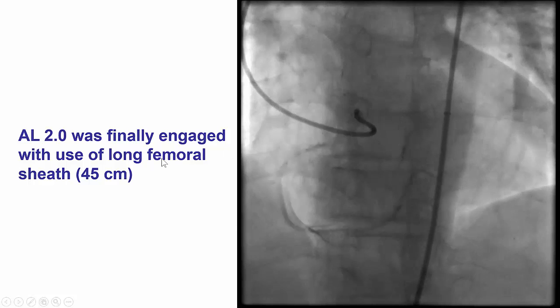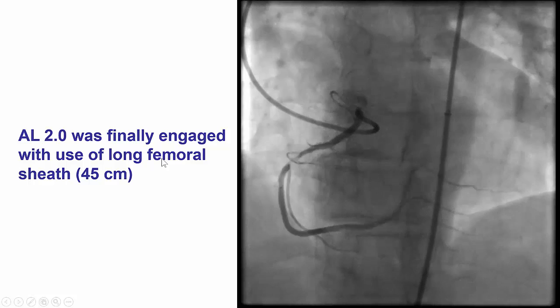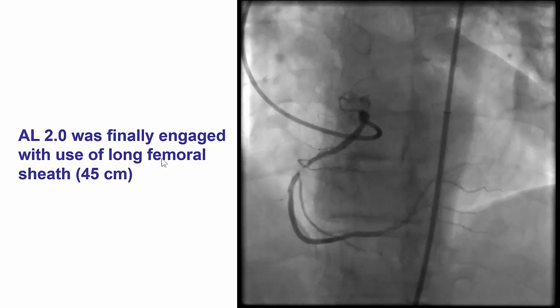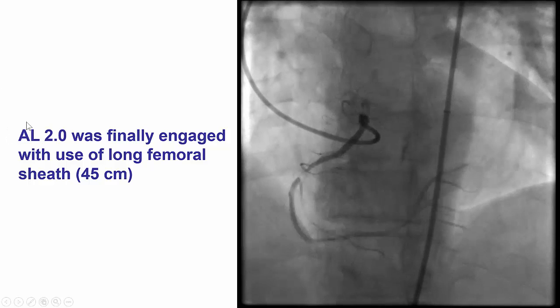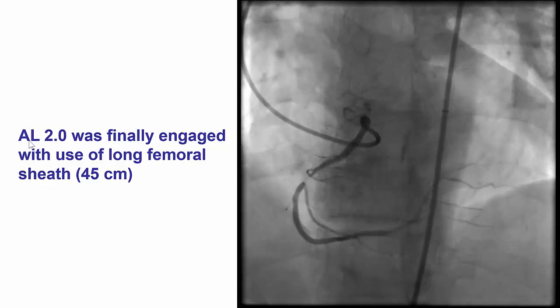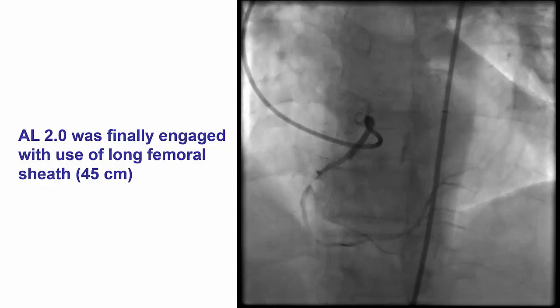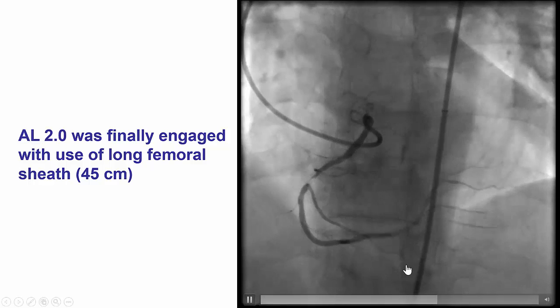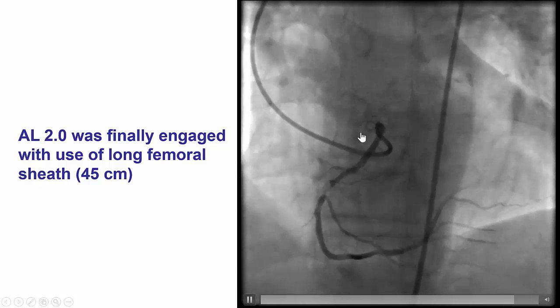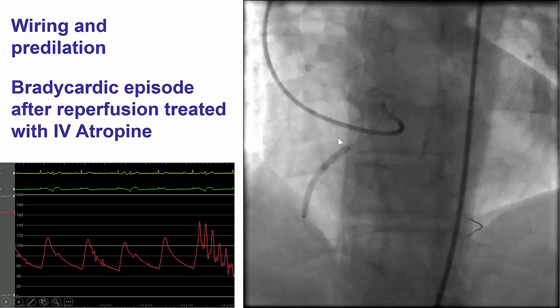After multiple attempts, and while we were actually contacting the cardiac surgeons in case we were unable to re-canalize the right coronary, we were finally able to engage the right coronary with a 2.0 Amplatz left catheter advanced over a long femoral sheath — you can see the marker of the sheath here — providing extra support. After doing that, we were able to wire the lesion relatively easily and deployed a long drug-eluting stent.